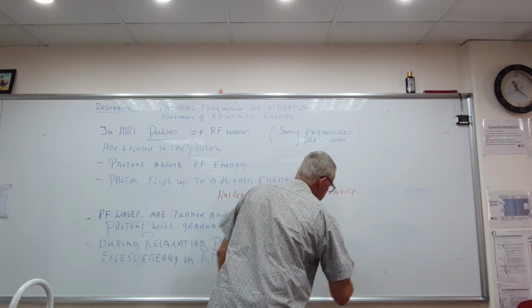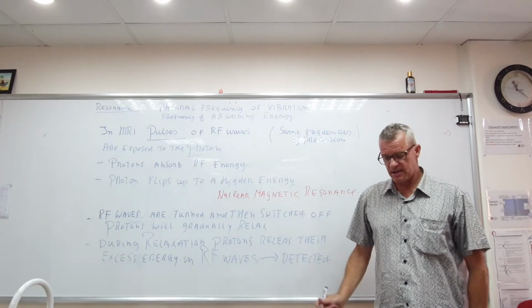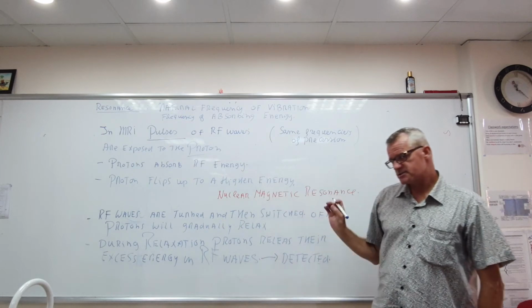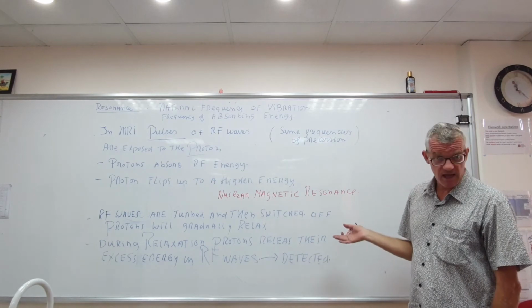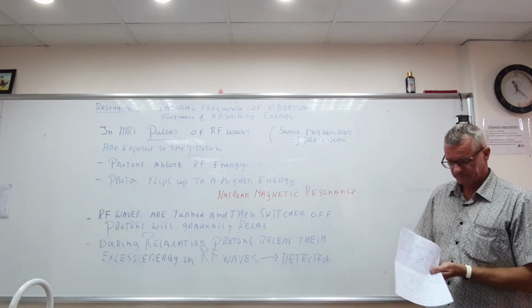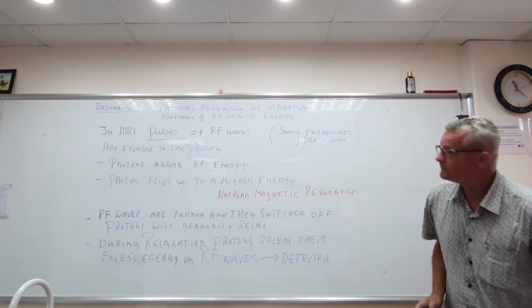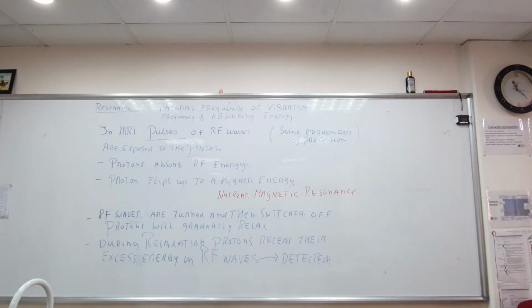So when we go back to the beginning, we said radio waves are going inside the body with pulses. Then there's a relaxation time. During the relaxation time, radio waves are released as an excess of energy, and these radio waves are detected. Okay? Now, what does it have to do with the different tissues? I'm going to explain you that now. So make a small note. And we continue.